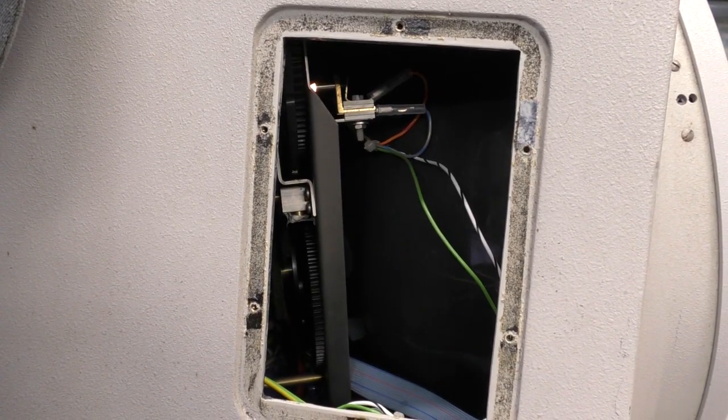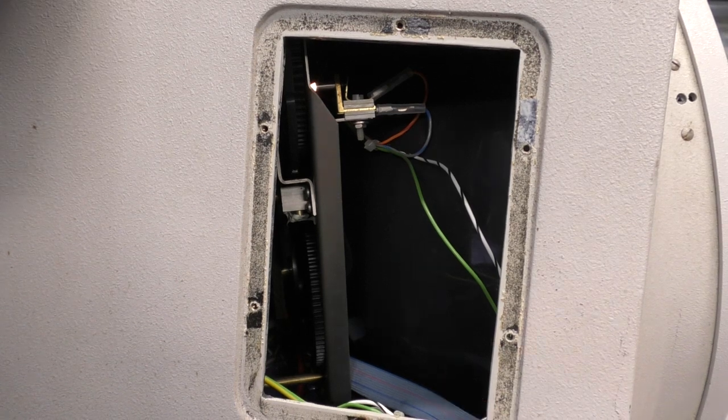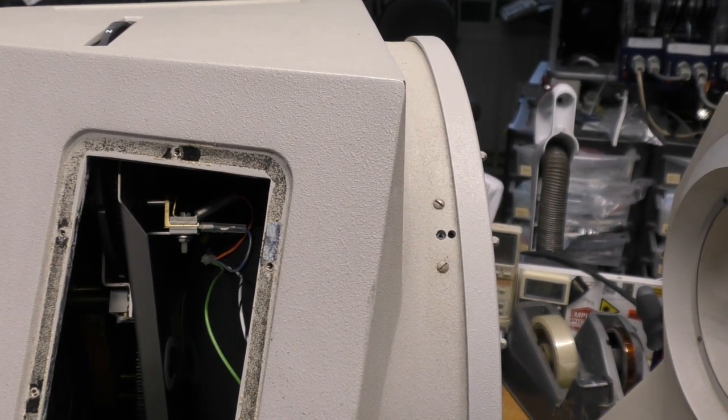One thing I noticed every so often when you fired it, you'd hear a bit more of a sparky noise, and I actually saw a little shower of sparks on the inside of here. That flash tube is accessible through here, but I'll take it a bit more apart so we can see that detail a bit more easily.